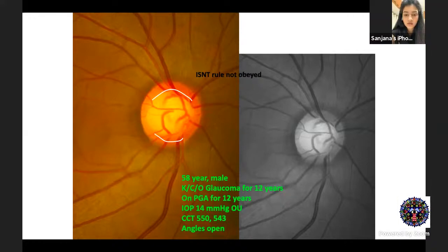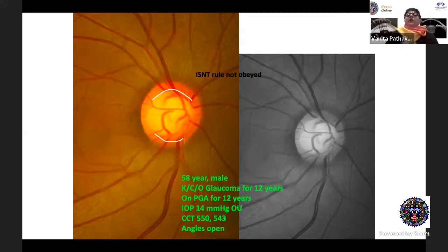By looking at the nerve fiber layer. RNFL. Absolutely. So you just said nerve fiber layer is absolutely fine. There is no nerve fiber layer defect. Look at the red free also. Beautiful nerve fiber. So superior and inferior arcuate fibers, fantastically patterned, textured. And you always have a transition to a less brighter papillomacular bundle. Don't forget that also. So that may just tilt your decision, saying that, okay, maybe that is the pathology here. But no, you can still see pattern. You can still see texture.